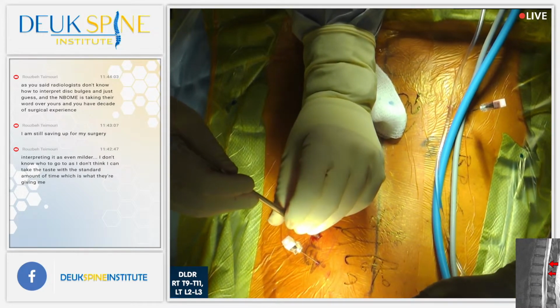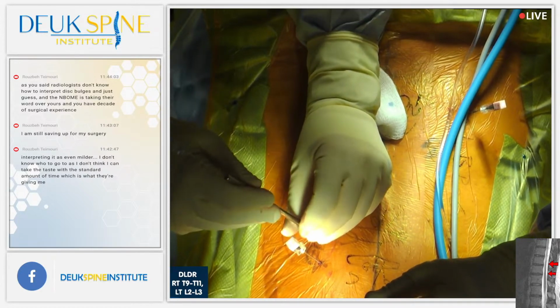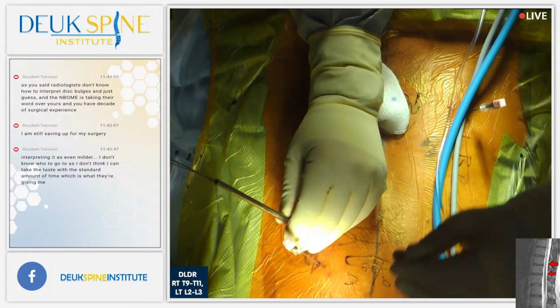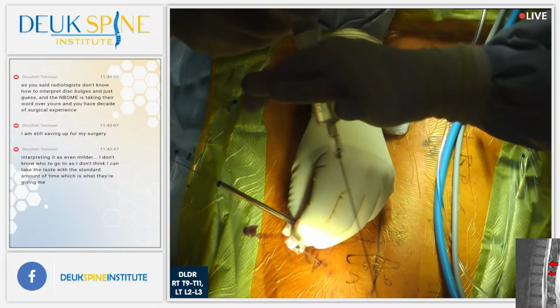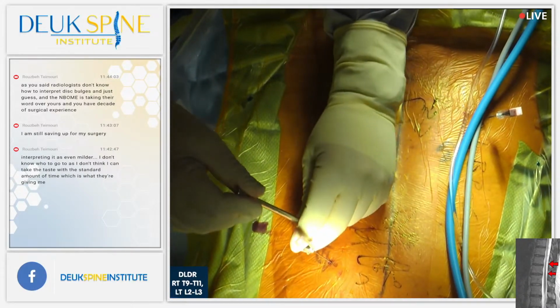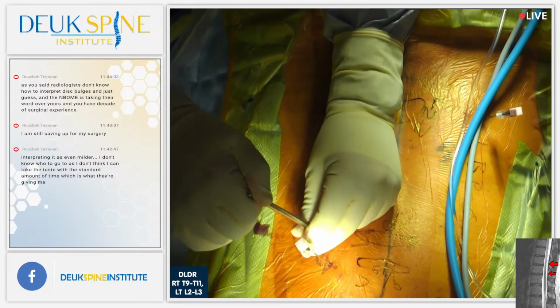the fascia. Shot. And I'm going to give him a little medicine in the muscle. Right there. I went through. I could feel it. Surgeons have to feel things. I don't know if you guys know that, but we're really good. Good surgeons are good at feeling. And what we're feeling are called tissue planes, P-L-A-N-E-S. What it means is we can feel the different tissues as we pass through them.